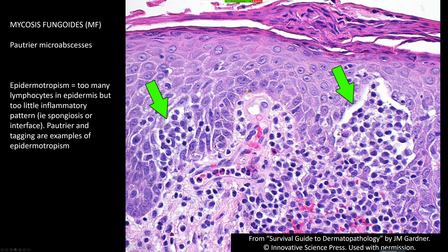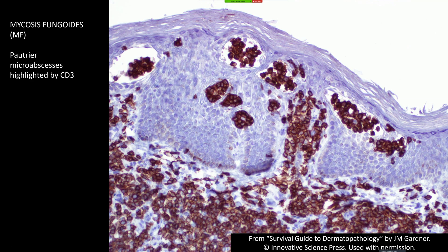Looking closer at the Pautrier micro-abscesses, they look an awful lot like Langerhans cells, which like to aggregate and make pools or nests in the epidermis — especially in spongiotic dermatitis like contact dermatitis. The distinction: if I'm not sure whether those are Langerhans cells or T-cells, immunostains will easily solve that. If they're Langerhans cells, it's probably just reactive. If they're T-cells, this is almost certainly mycosis fungoides or another epidermotropic lymphoma. There are other epidermotropic lymphomas, but that's complex and beyond the scope of this talk.